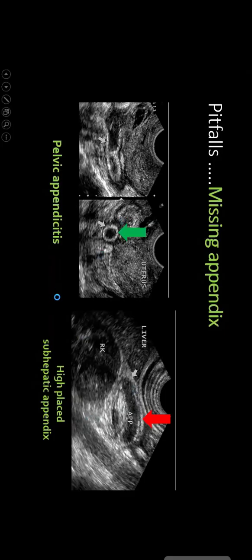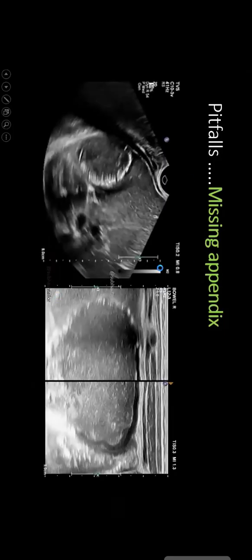This is pelvic appendix. Again, a pediatric patient with acute abdomen, fever, missing appendix. There was a large abscess in the right flank. This is liver, this is right kidney. In the transverse plane, the abscess is extending from hepatorenal space to the right iliac fossa. There was large, massive abscess with internal echoes and air foci within it.